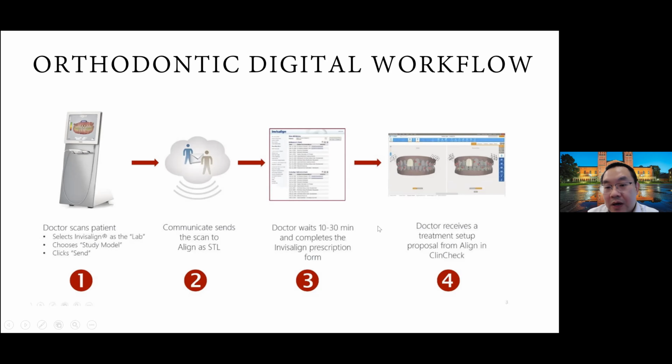That usually takes within an hour, you should get the treatment plan back. And then it will churn out the trays in sequence and send them to the patient. All right, so that really streamlines the process, saves the patients a lot of time, and encourages the patient to not do those DIY kind of Invisalign or liner systems, right? Because it makes it so much easier to go to an orthodontist to do this.